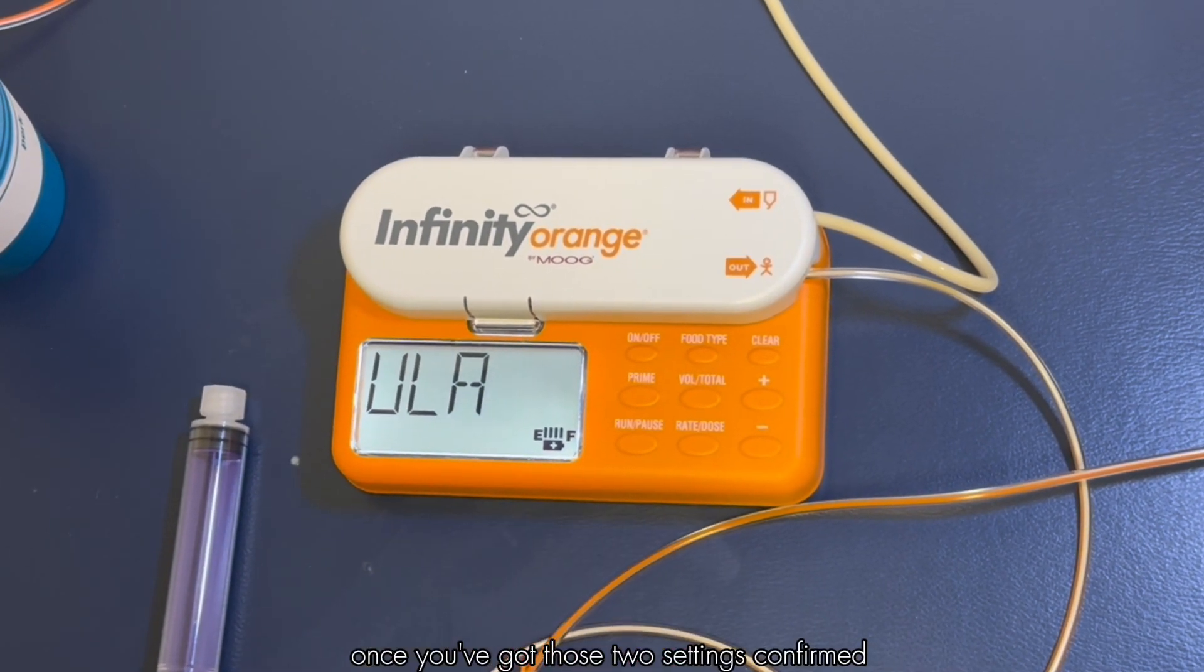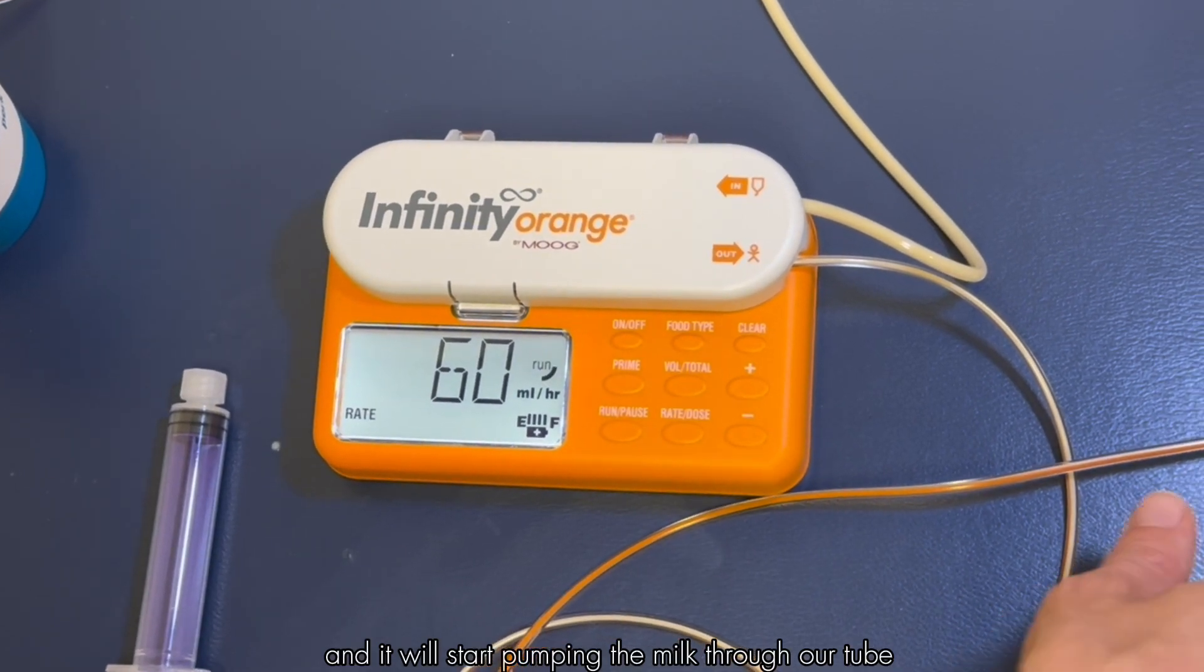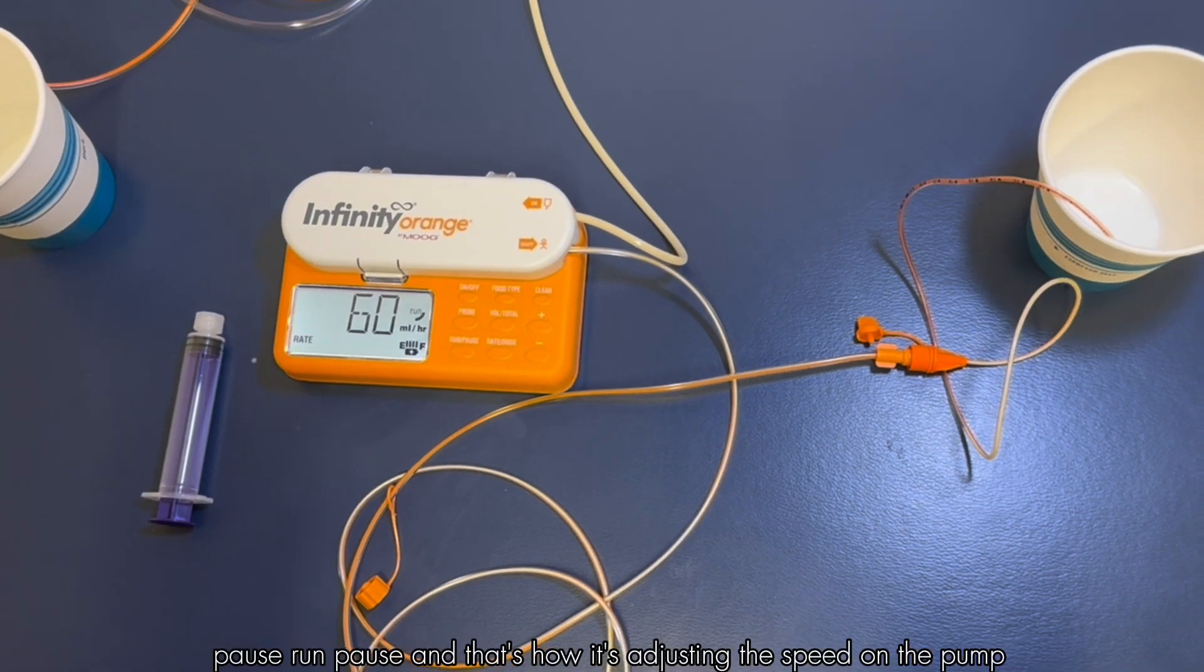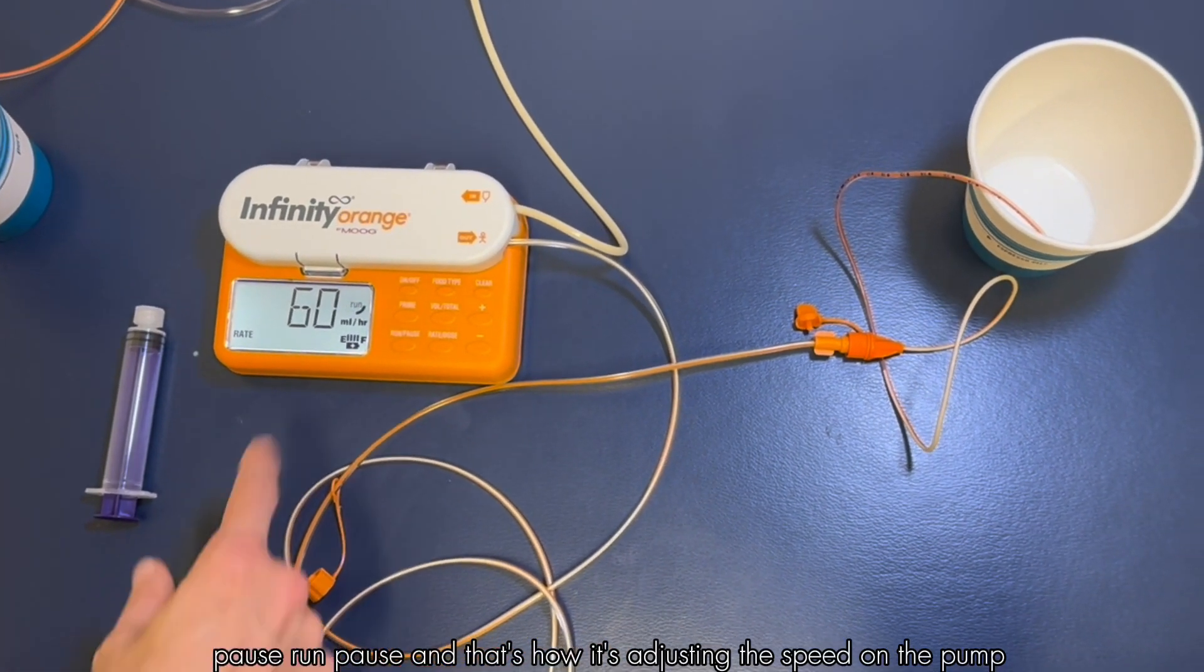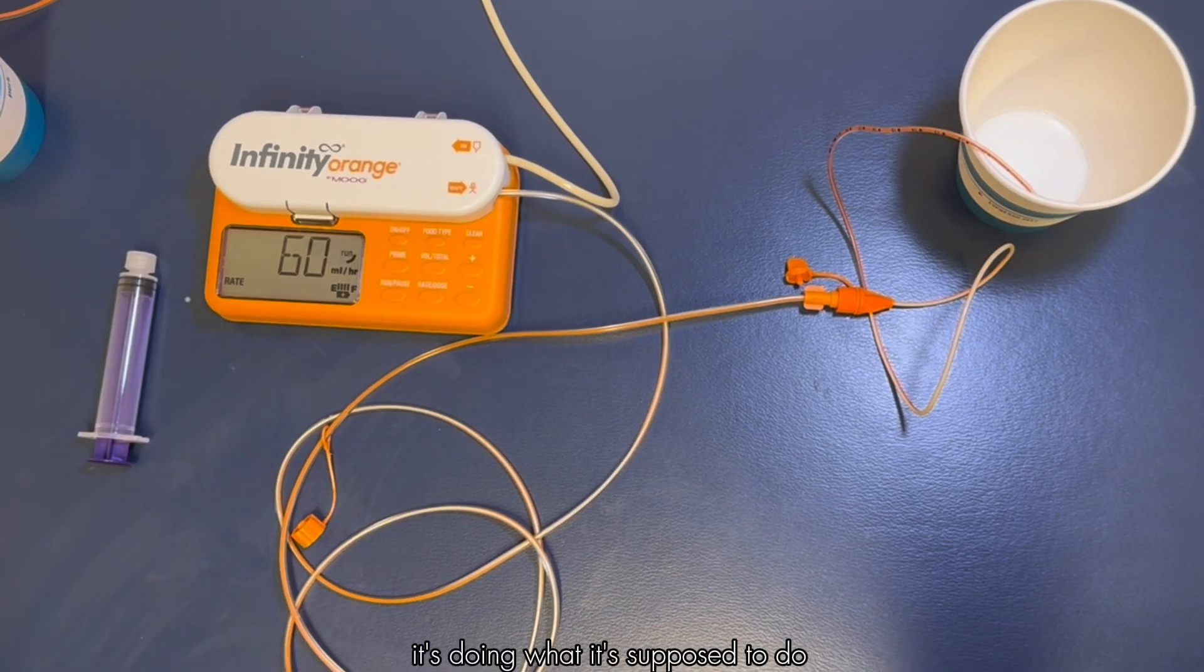Once you've got those two settings confirmed you can hit run pause again and it will start pumping the milk through our tube. You'll hear it run pause run pause and that's how it's adjusting the speed on the pump. As long as this little circle is going around that says run it's doing what it's supposed to do.